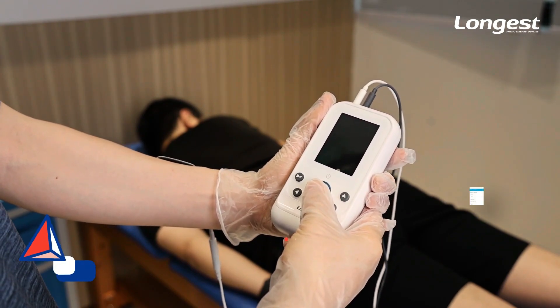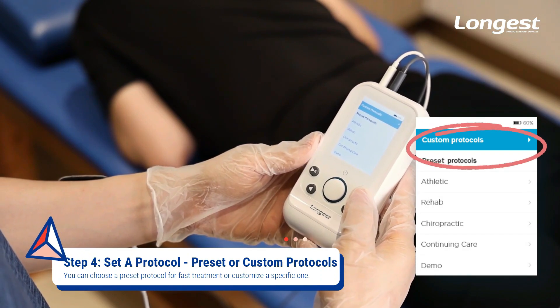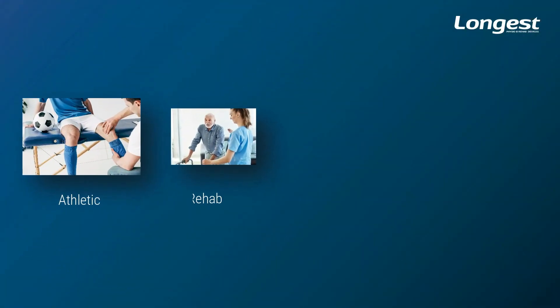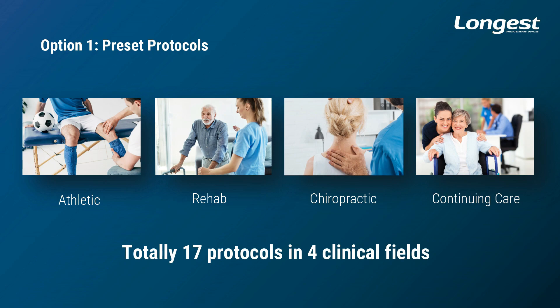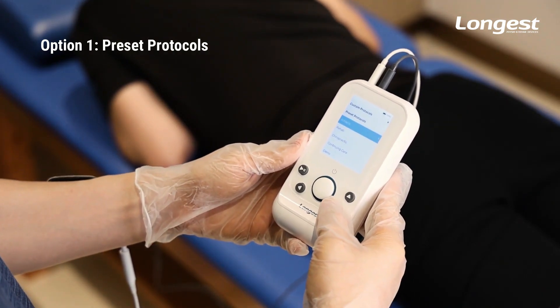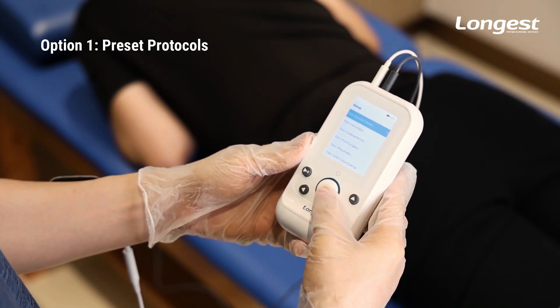Long press the button to turn on the device. There are preset protocols and custom protocols for options. The preset protocols cover four clinical fields: athletic, rehab, chiropractic, and continuing care, providing you with a fast therapy option. Pick one that suits the patient's condition, press the button to select, and press the central button to confirm the selection.